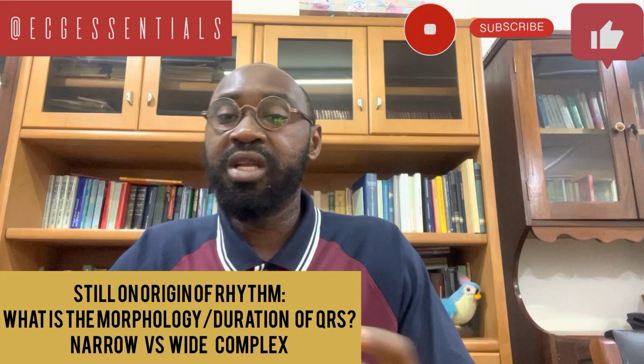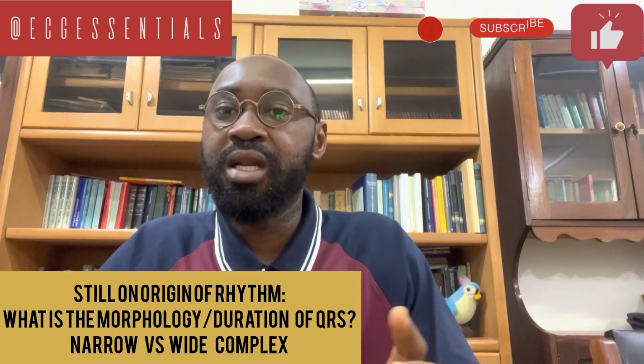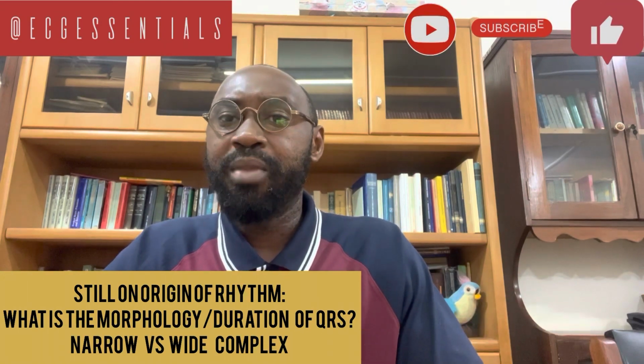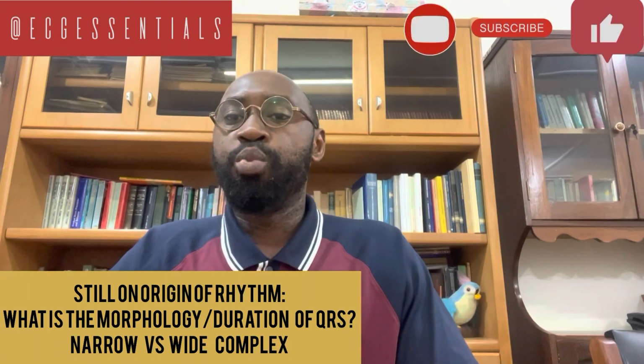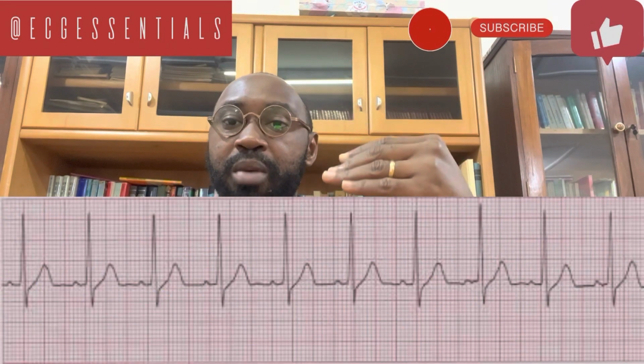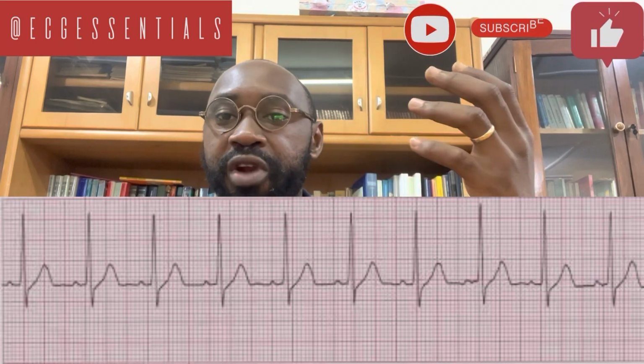When we see that the QRS complexes are narrow, in the sense that they are less than the 110 milliseconds that is allowed, then we outrightly know that this will have to be a supraventricular event. So it may be from the sinus node, it can be from the atria, it can be a junctional rhythm. That is provided the QRS complex is narrow.